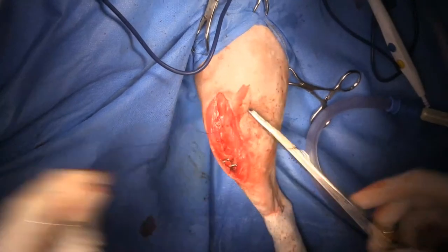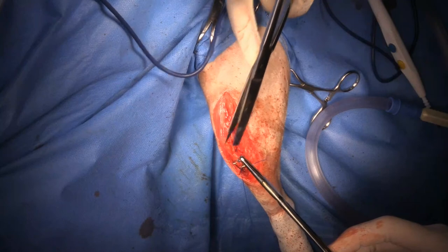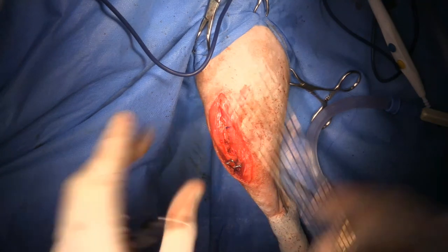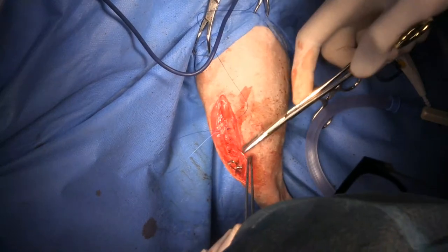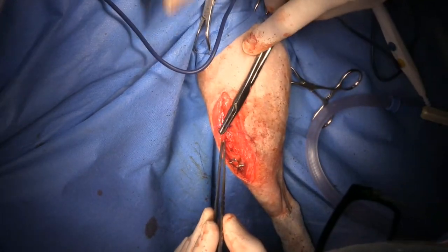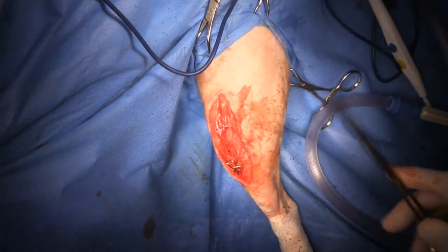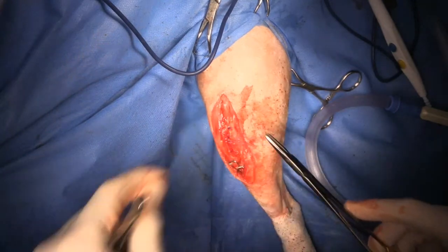I know there are a few questions - I'll save them for the end when I can go over and have a look. Distally here I'm going to try to pull that cranial tibial fascia over the top of those pins to reduce the likelihood of irritation from the pins through the skin.